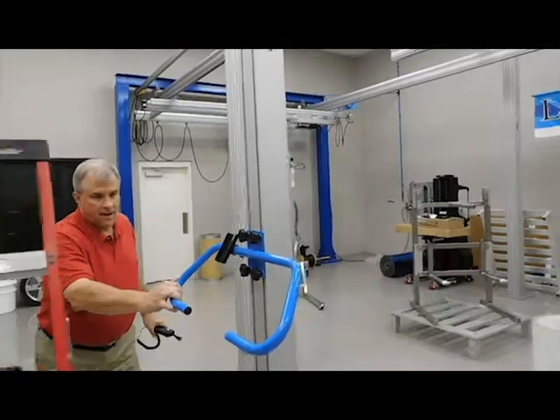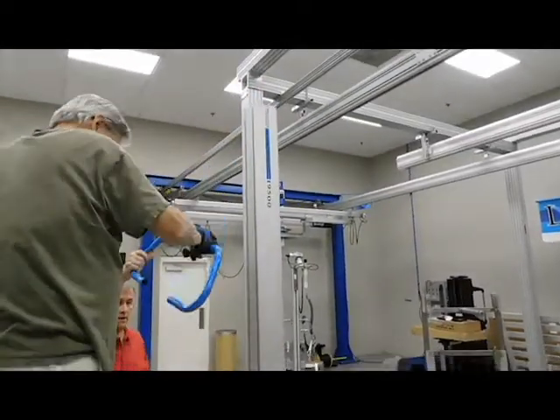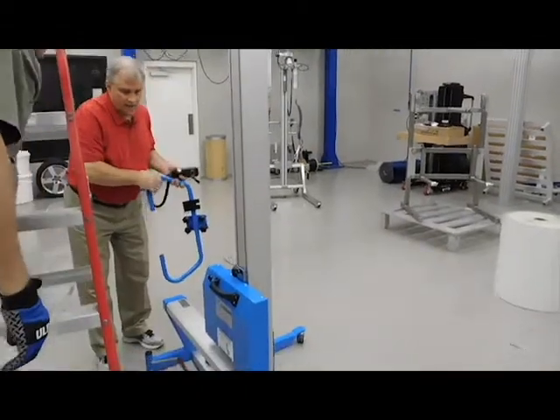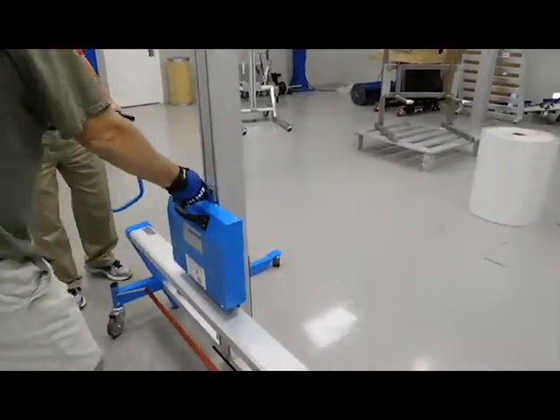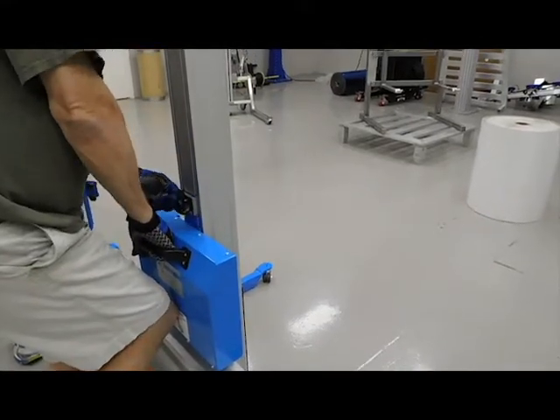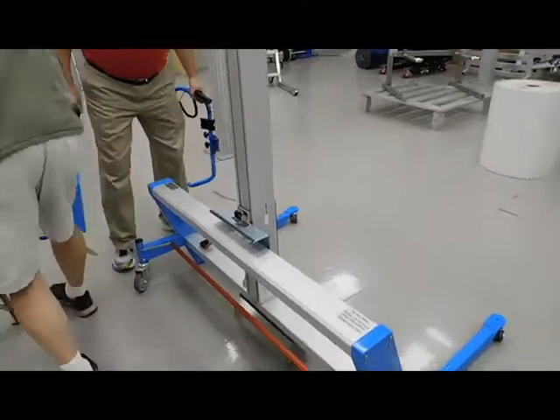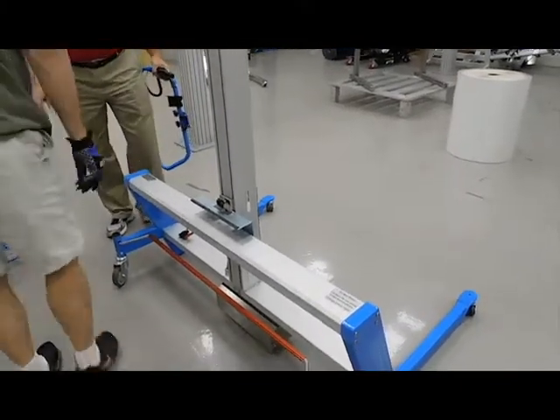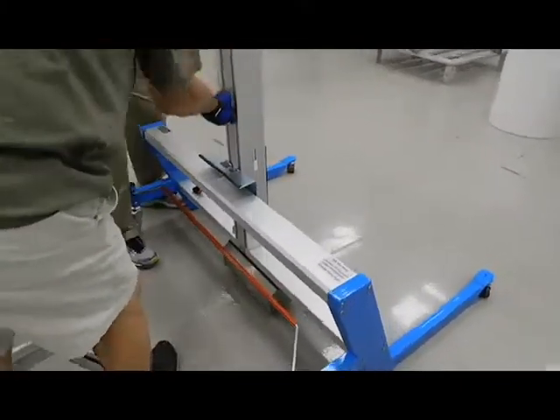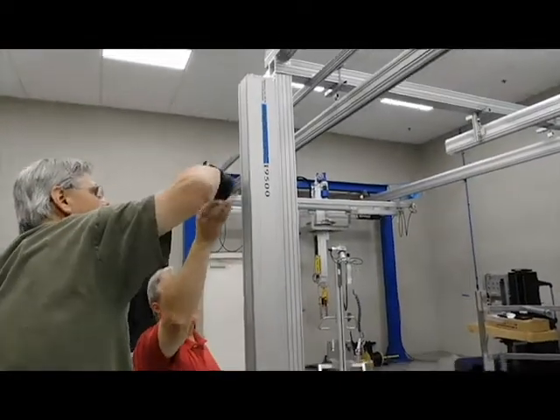Lifter is locked in place, so we're going to take the handlebar off first. I'll take it. And then when he comes down, we're going to take the power pack off. So you unloosen the bracket and just pick it up. And there's the power pack. Set that on the floor. We're going to run the bracket all the way back up to the top. We're going to take that off.